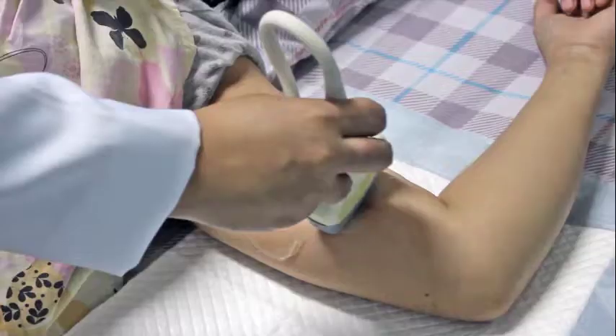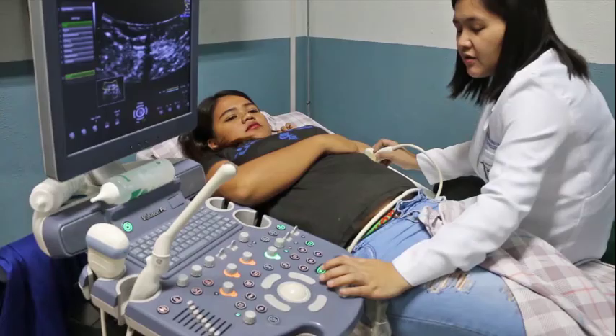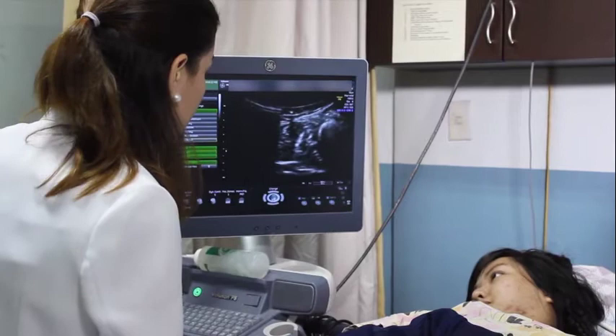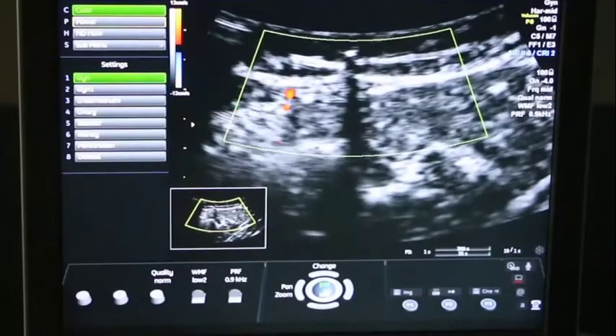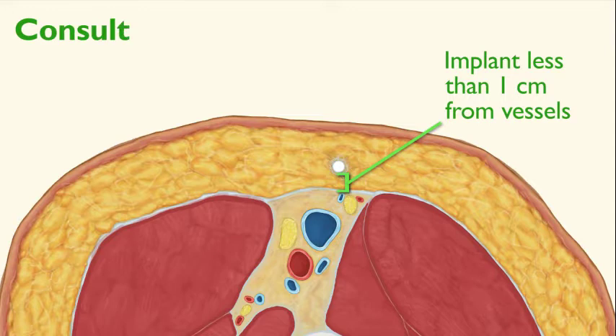This will increase the contrast and allow you to see the implant and acoustic shadow more distinctly. Scan for the implant in the transverse plane of the arm with the probe perpendicular to the implant. In this plane, look for the implant's acoustic shadow seen underneath the implant. Identify the actual implant as an echogenic white spot found at the top of the shadow. If available, turn on color to evaluate for nearby vessels. If the ultrasound study demonstrates blood vessels or other vital structures less than 1 cm to the implant, consult with a vascular or neurologic surgeon, or a surgeon experienced in complex surgery, to perform a collaborative procedure.